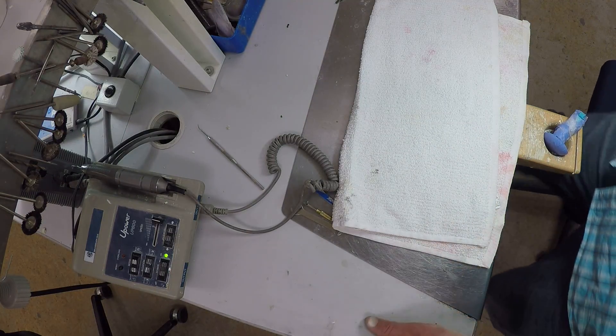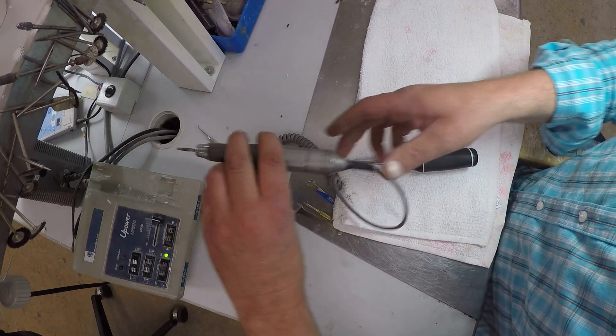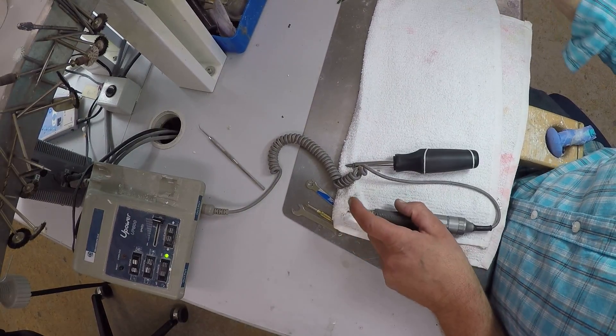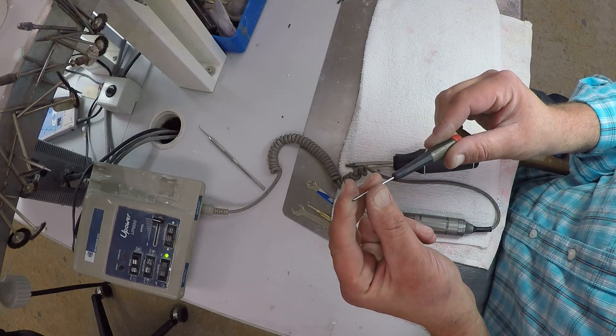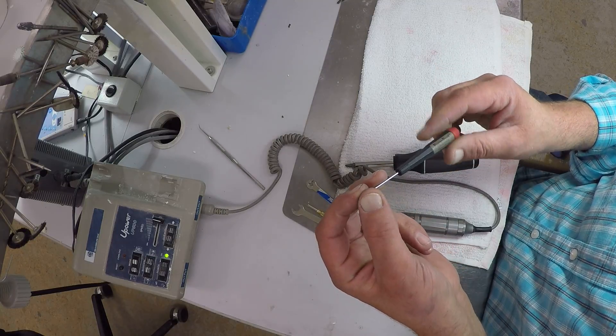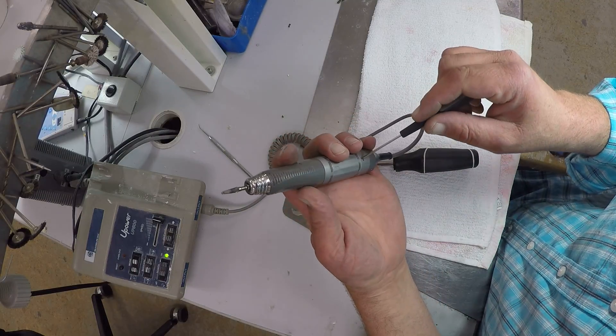Just get ready here. I've got a flathead screwdriver. I'm going to use one of these implant screwdrivers — just a little miniature one. You could use an eyeglass repair kit for that. Works the same probably.